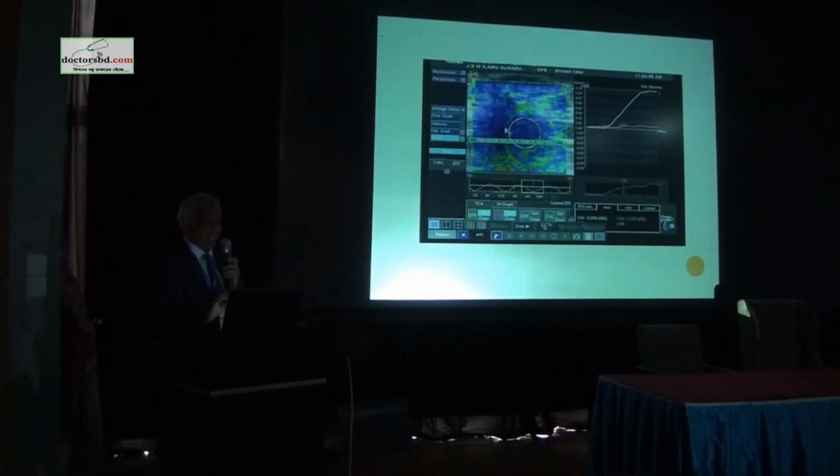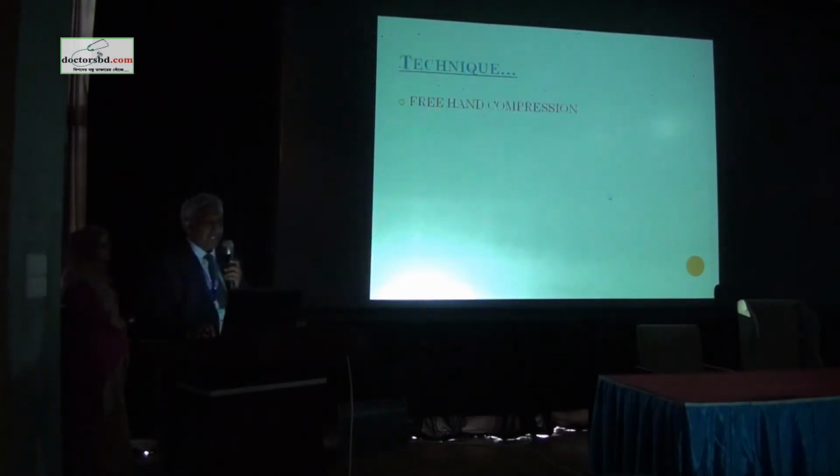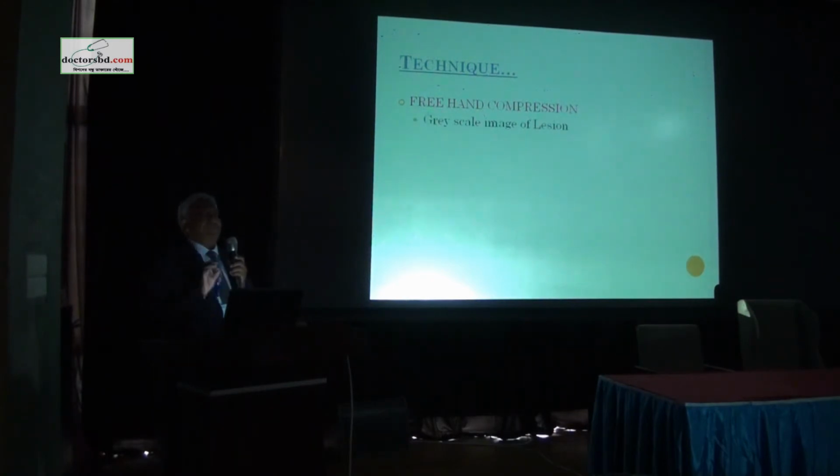Another example over here, look at this elastogram. You find the blue area, and a mix of green as well as red areas. When you put the cursor over the blue area, which represents the harder area, and compare with the tissue stiffness at the green area, you find the strain ratio, tissue lesion ratio, measuring more than 7, that likely represents malignant kind of lesions. This technique is very simple.